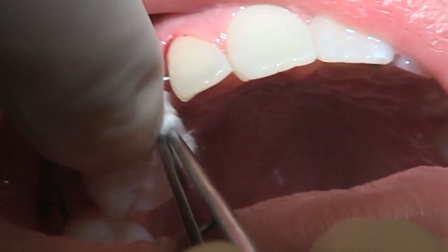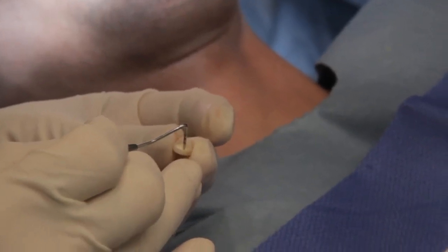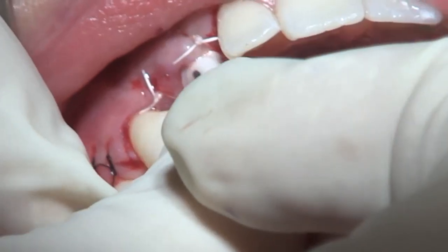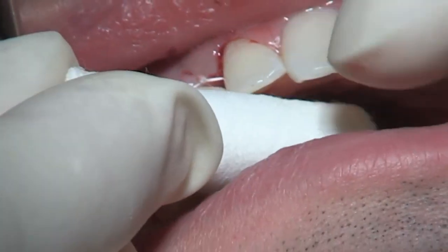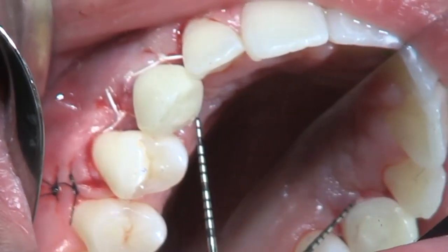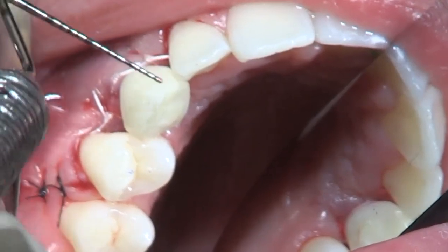The access hole of the abutment is occupied with a filler like a cotton pellet or impression material. Then we're ready to insert the temporary crown with cement onto the abutment. For the purpose of the immediate temporization, we'll use a cement of temporary duration so that the crown can be removed when needed. As a final step in today's procedure, a probe or explorer is used to remove any excess cement from the subgingival space.